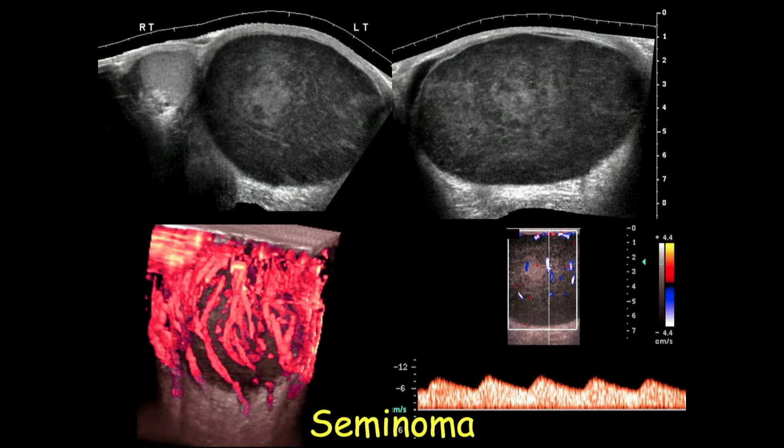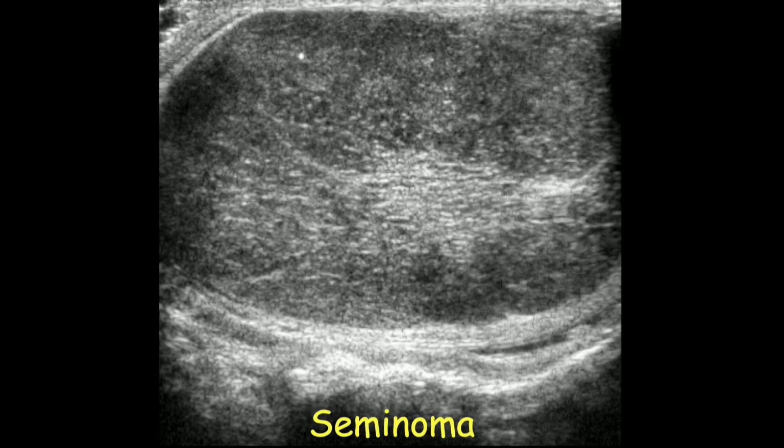This was a really nice guy, a farmer who had noticed a slowly growing scrotal mass, but he was very stoic. He wanted to bring his crops in, so he came in with delayed diagnosis. Look at the size of this seminoma here, how vascular it is. But again, if you had to pick a tumor to get, this is the one to pick. He had orchiectomy, no nodes. He was doing great 5 years later. So this is a good tumor to pick here.